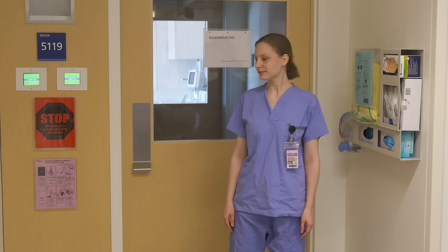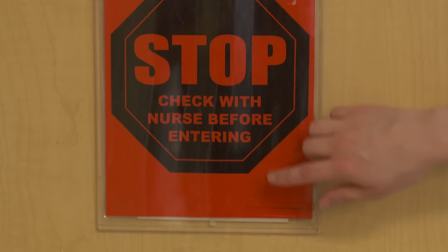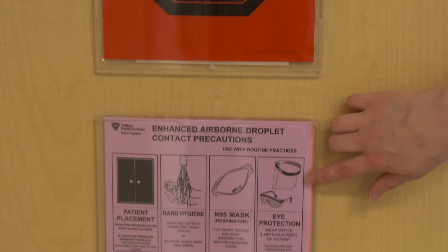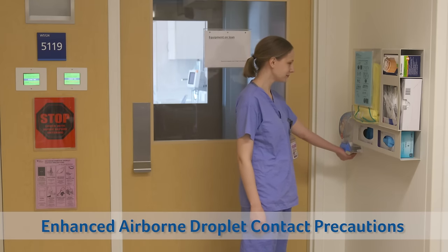When donning PPE, begin by checking which PPE is required by reviewing the signage outside the room. To reduce risk of transmission, ensure hair is pulled back and jewelry is removed or minimized.